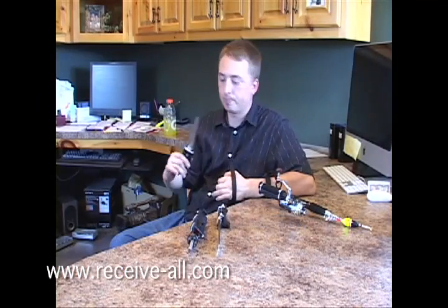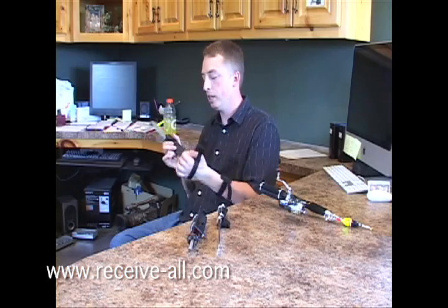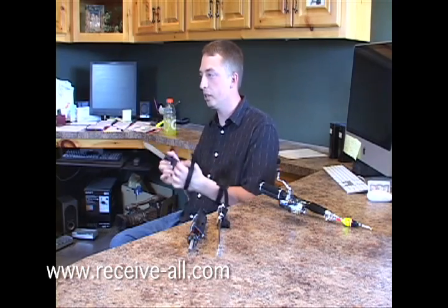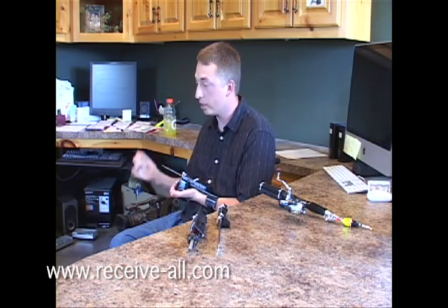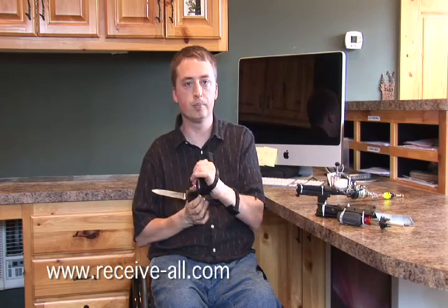Next, I live at home independently by myself, and certain foods I have issues cutting, and so I have knives that are ready to go in adapters, and I can safely cut. In this case, with this knife, I can cut my own steak. So now I can have the food in front of me, and I can do this independently.